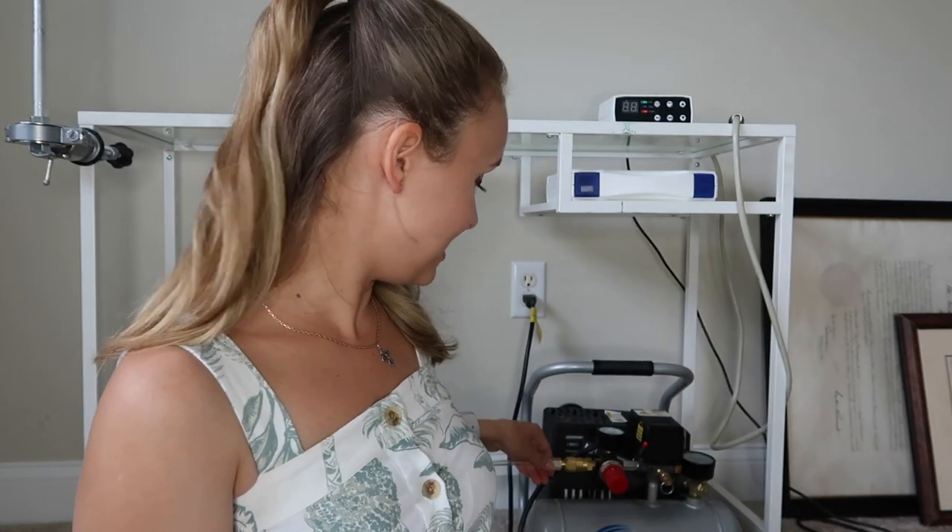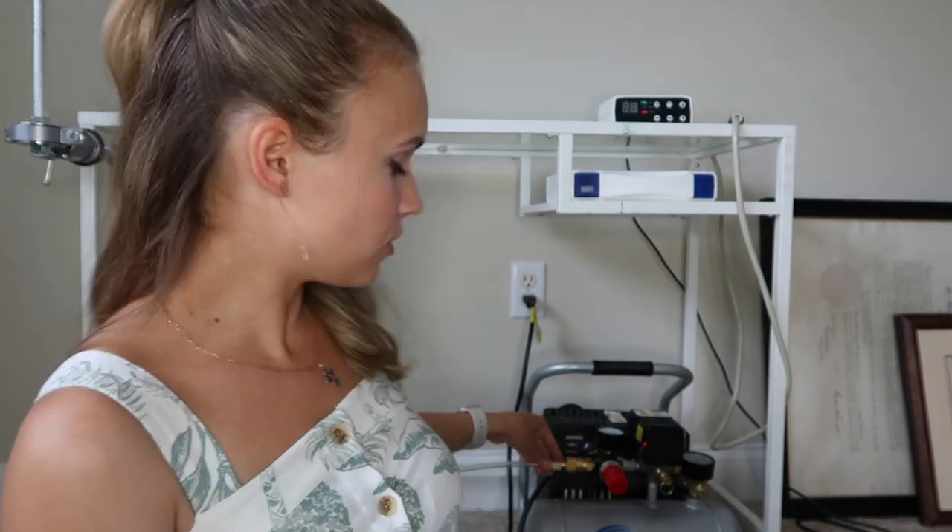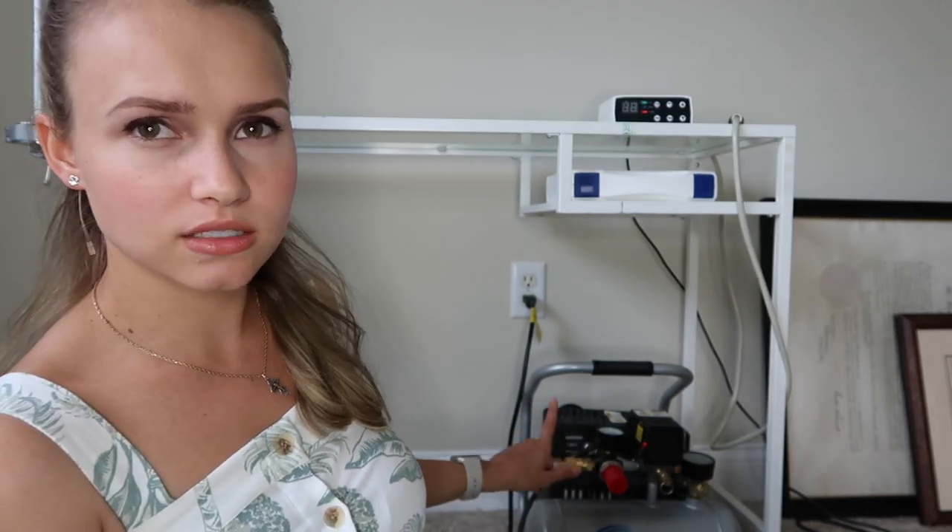This is pretty much how my compressor is hooked up. Some people recommend Teflon tape so the air doesn't leak out. I didn't have problems with air leaking at first, but I do now — I think because it's an older unit. I can feel air leaking right out of this brass fitting, so Teflon tape would probably solve the issue if you have a similar problem.